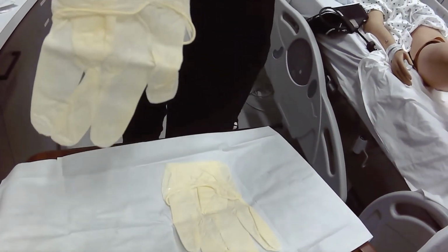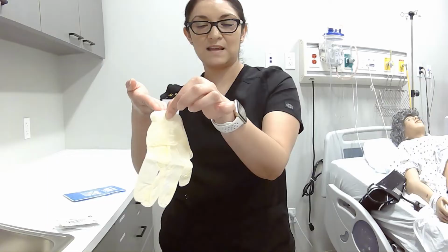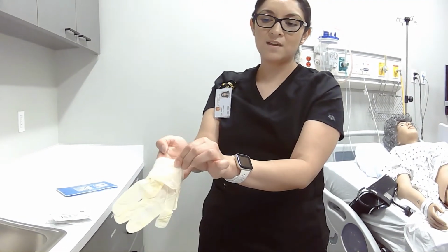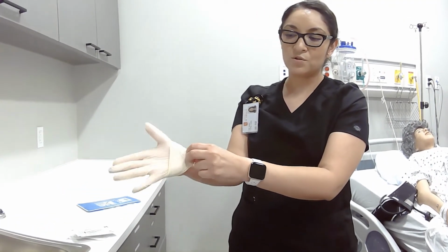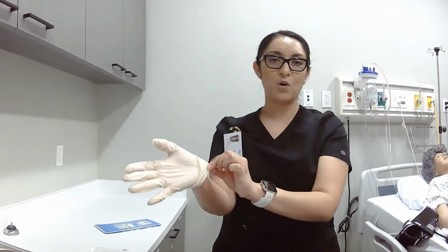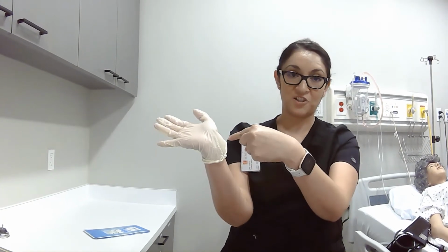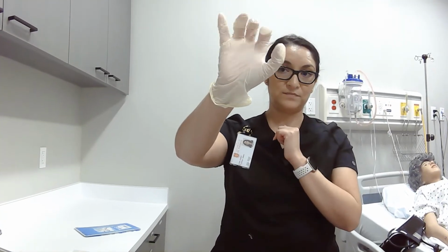So I'm going to pick it up with my non-dominant hand, taking a step back so I'm not messing around with my sterile field, and I'm going to slide my non-sterile dominant hand into the glove, okay, of that right hand. So you'll see the thumb is always going to be on the exterior. So you always want to put your hand in that direction. So I'm going to pull back on the cuff without touching the inside or the exterior, I guess, at this point, because this is sterile, okay?